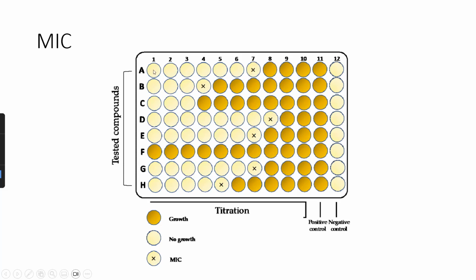So the antibiotic has been able to kill the bacteria for all of these smaller and smaller concentrations, but this is the breakpoint. At the next smallest concentration, the bacteria are able to grow. So we see minimum inhibitory concentrations with the ones that are labeled with an X. That's the last well where the antibiotic is still working to kill the microorganism before the microorganism overcomes that antibiotic, or before the concentration of the antibiotic decreases so much that it's no longer impactful.